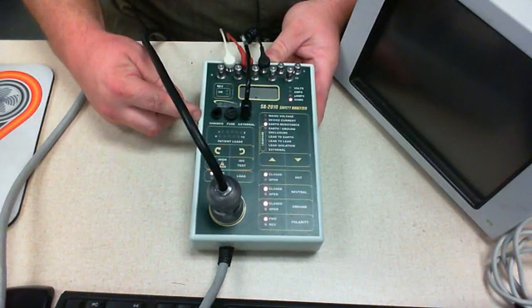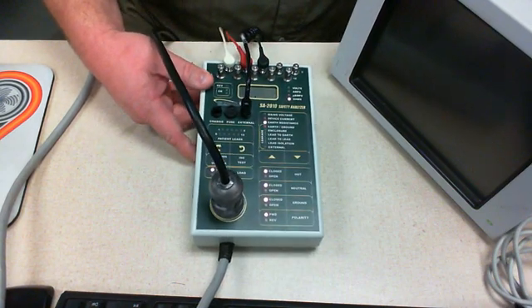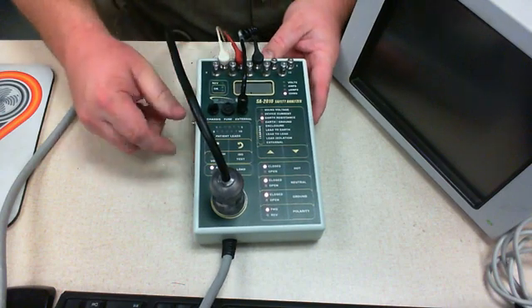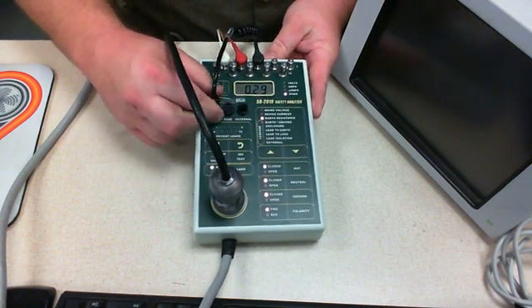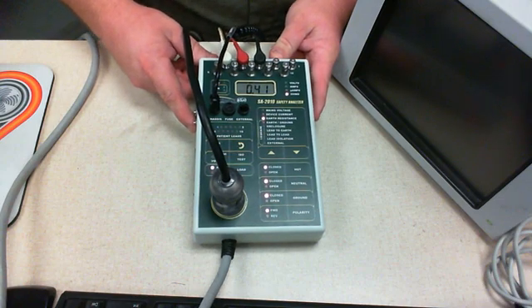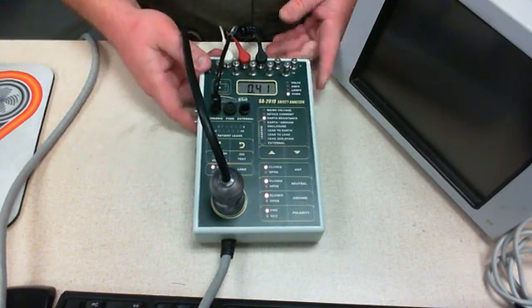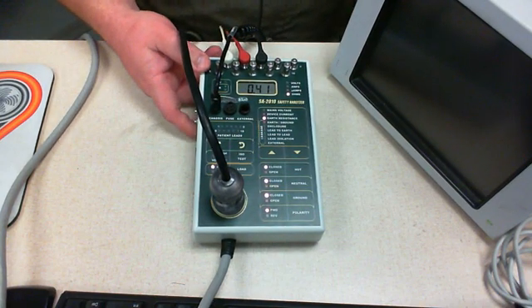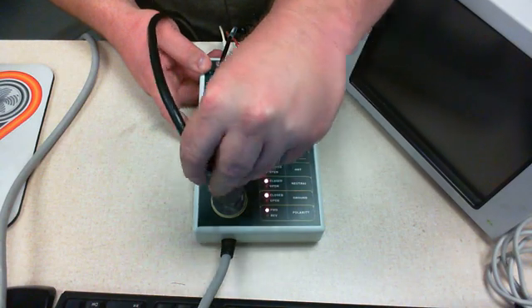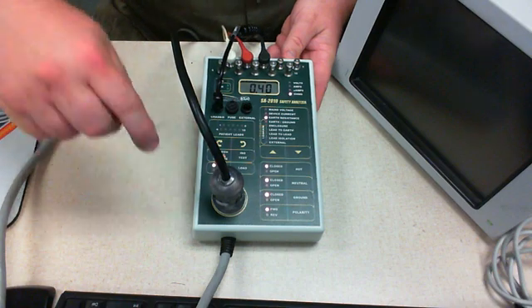Notice that's earth resistance. This is actually a much higher resistance than what I was getting previously — what I was getting before was much lower — but it's still passing. We're under 0.5 ohms, so I'm going to move on.